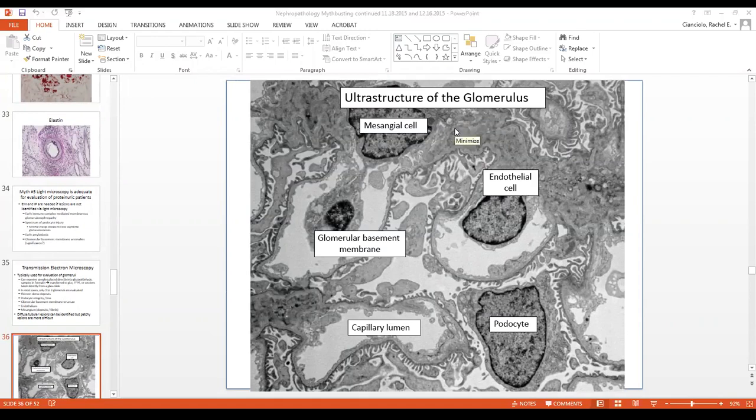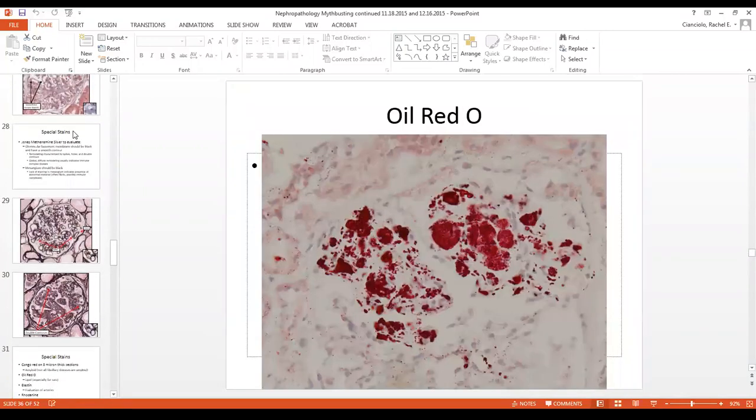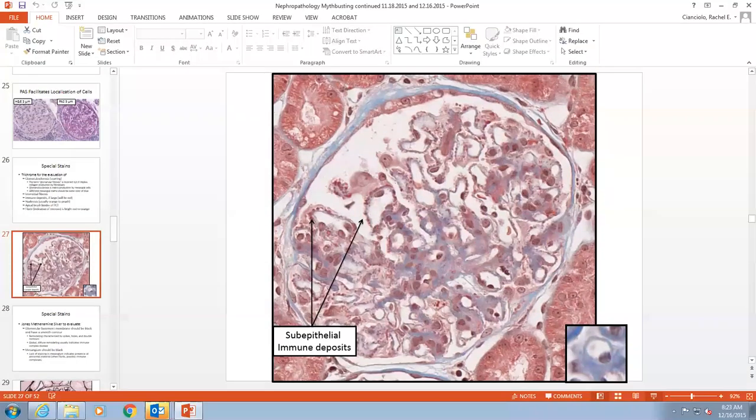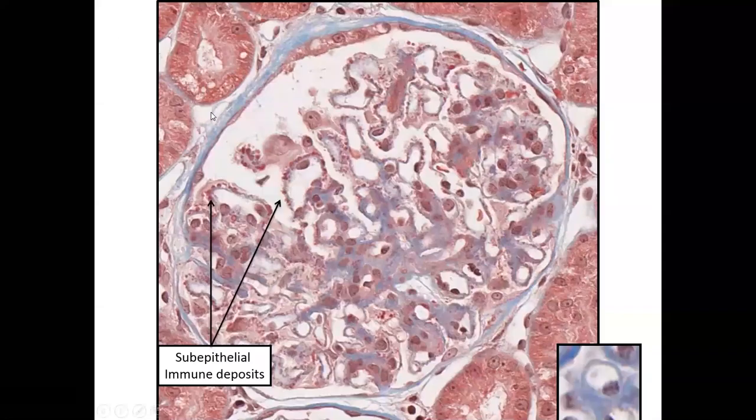Is that okay? Last question I had was going to be on the trichrome. You've sometimes exercised caution about saying fibrosis with trichrome in certain cases. Could you clarify that? Yeah, so fibrosis of the interstitium, is that your question? Yes. Okay, so sometimes what happens is if you have acute tubular epithelial injury, you have a lot of interstitial edema, and so what happens is your tubules move away from each other.